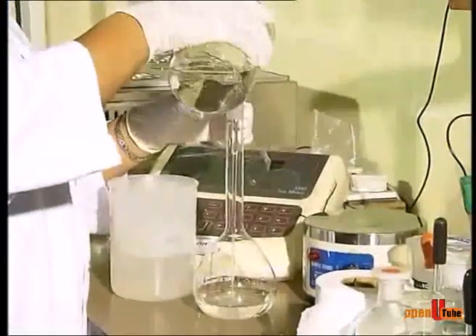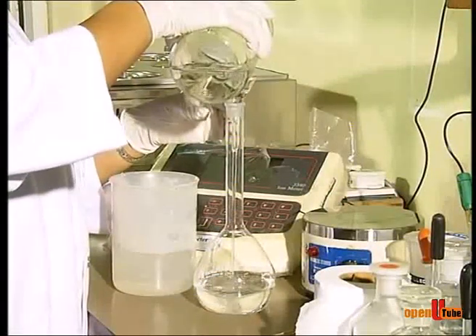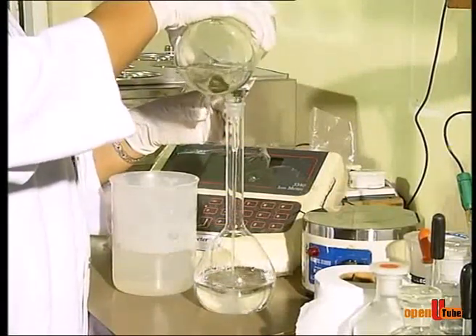Transfer the solution in the beaker into a 1000 milliliter volumetric flask and add distilled water up to the 1000 milliliter mark.